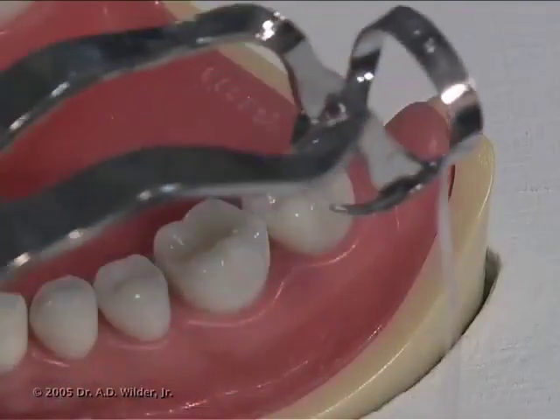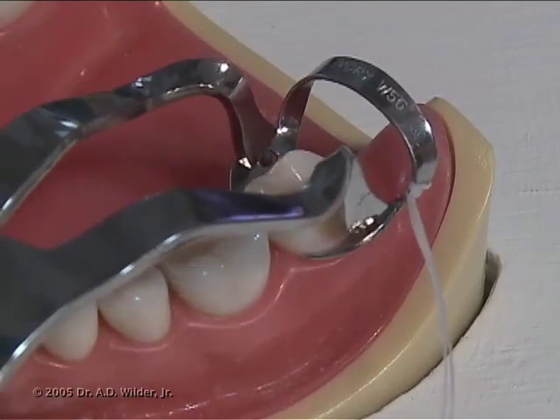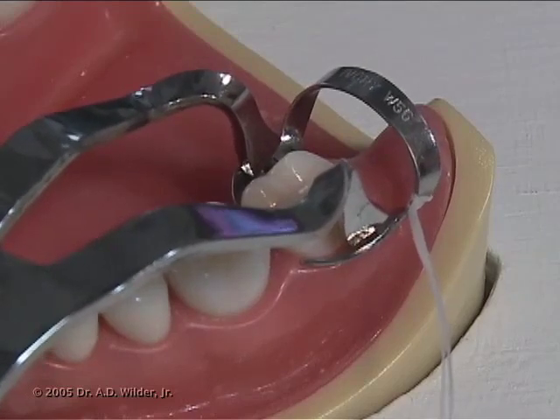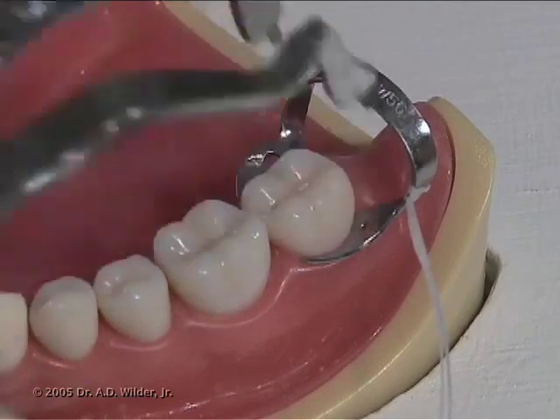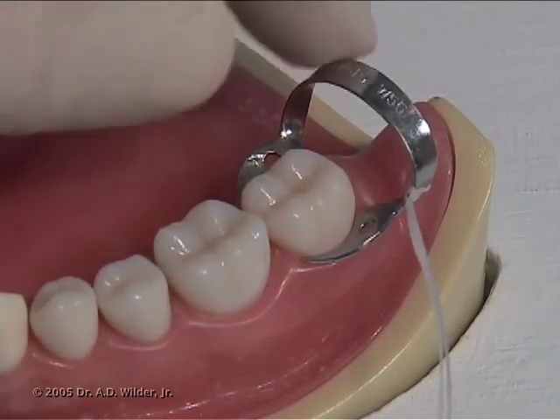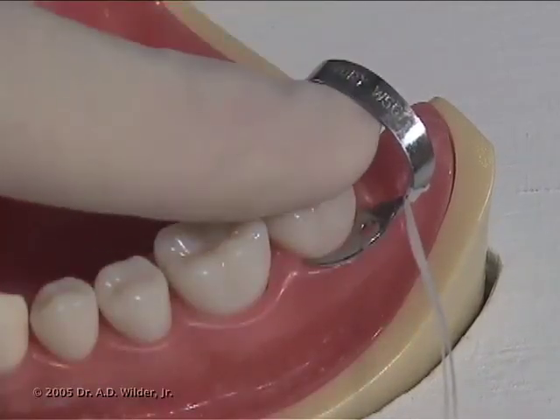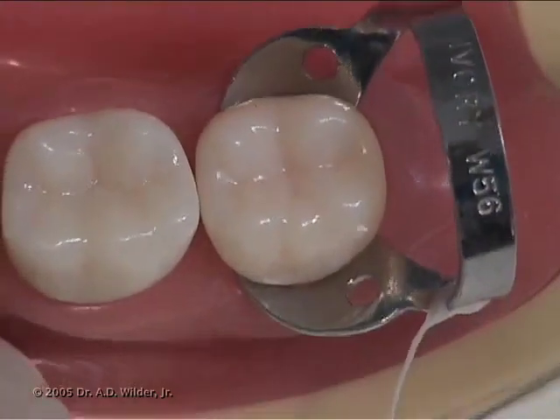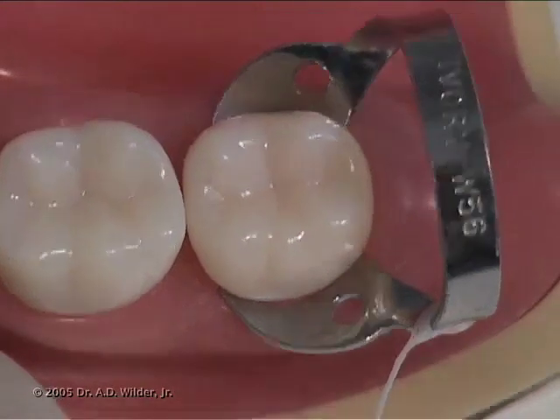Next, deliver the appropriately sized clamp to the tooth using a rubber dam clamp forceps. Check to make sure the clamp is stable and well adapted. Check to make sure that the prong tips are contacting each line angle of the anchor tooth.